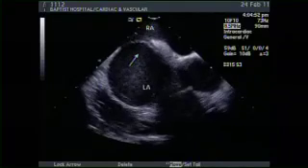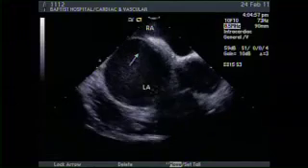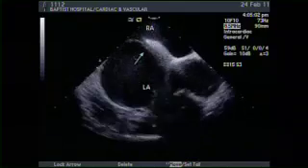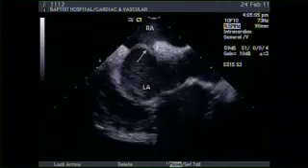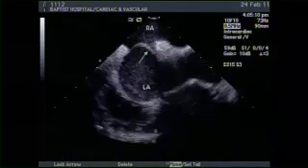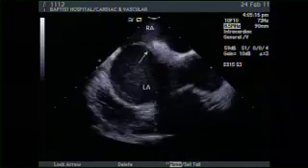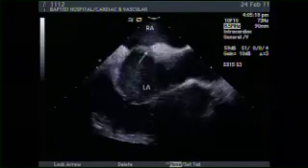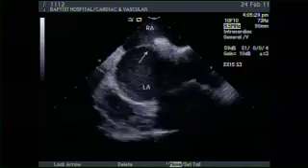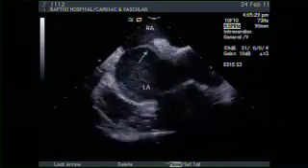To label the chambers of the heart, right atrium, left atrium. This small membrane that you see is the interatrial septum. And I'd like you folks to keep your attention focused in the area designated by the arrow. That's the site of the PFO. Dr. Quesada is going to inject a small amount of agitated saline in an attempt to demonstrate how bubbles may cross from the right atrium into the left atrium. In a similar manner, a small thrombus would cross, creating that stroke.